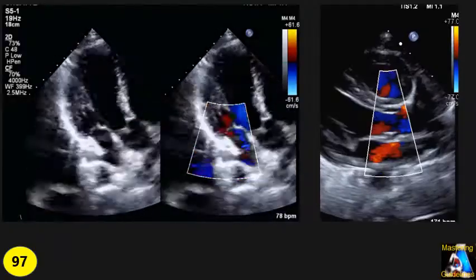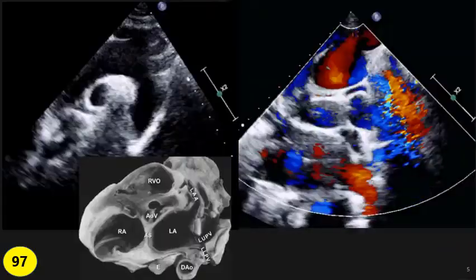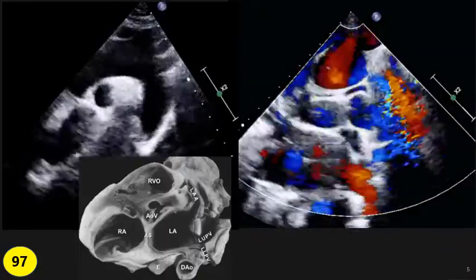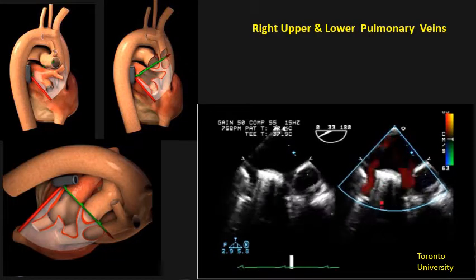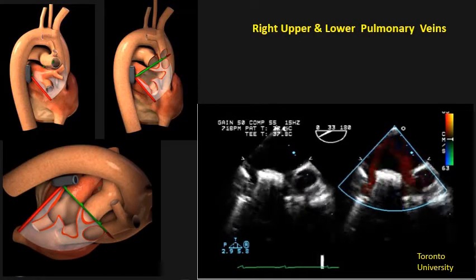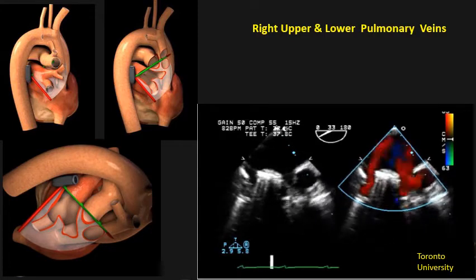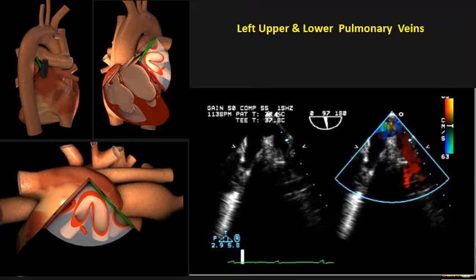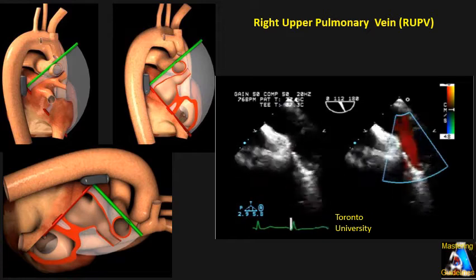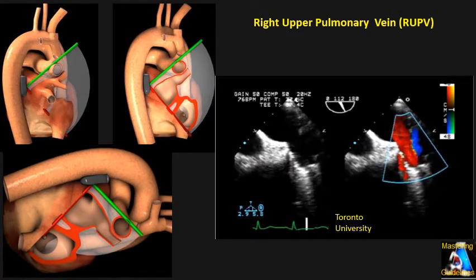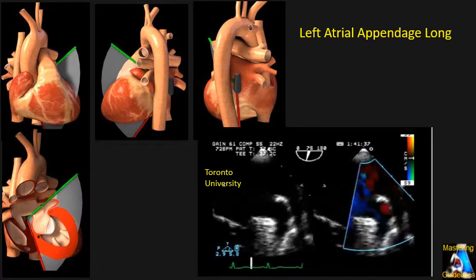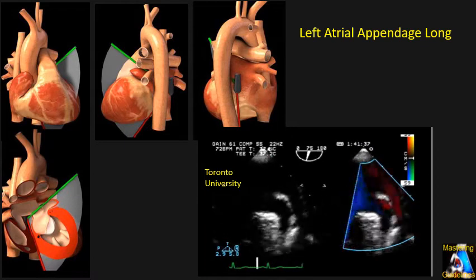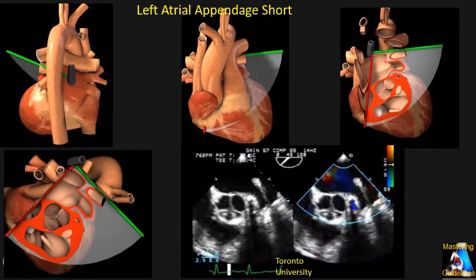Then unusual views and Doppler — short axis, apical four-chamber, and all those. Then we go over the pulmonary vein specific views for the pulmonary vein, each of them on transesophageal and other views where the pulmonary vein will typically be captured and evaluated.